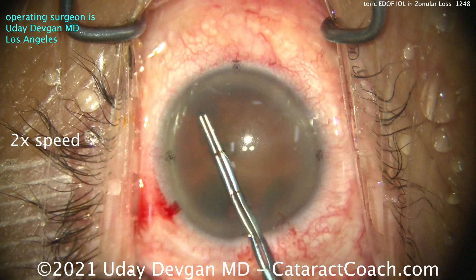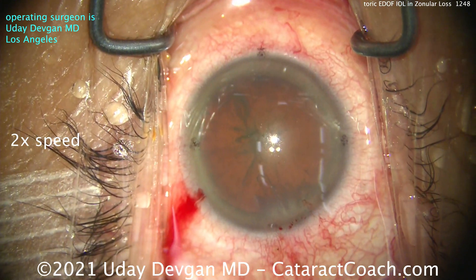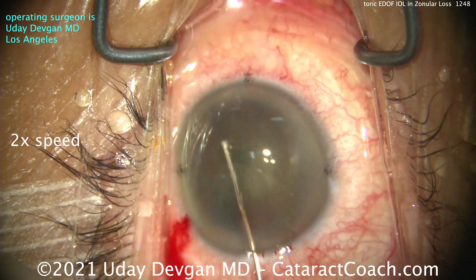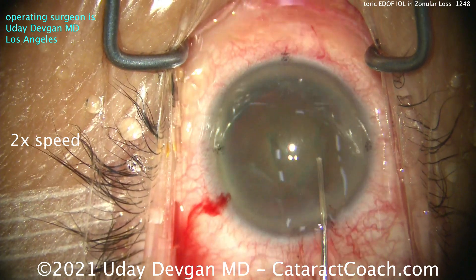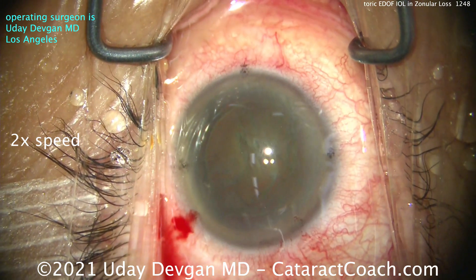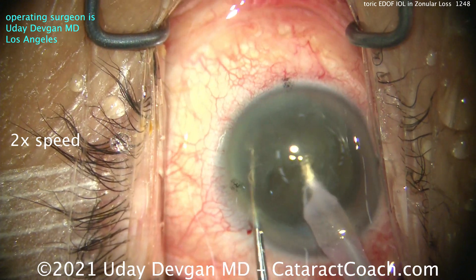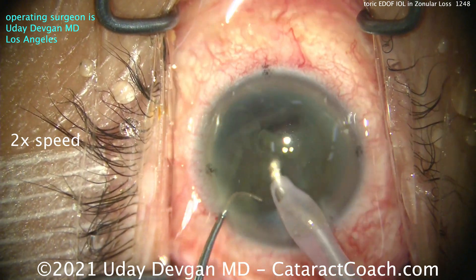So what do you do? Let's get the rhexis done, and I want to bring that nucleus out of the capsular bag. There's a 5mm rhexis — we've got a good rhexis. Let's hydrodissect and hydro-delineate. Let me get that central endonucleus out of the bag. If I can have the endonucleus removed while the epinucleus is still in the bag and holding things in place, I think that's going to help. So there's the endonucleus out of the bag. Get the chopper around that endonucleus, chop it, remove it — and I'm going to get surprised in just a moment.